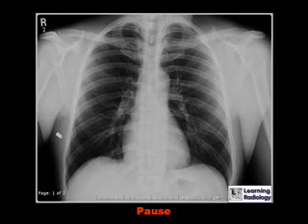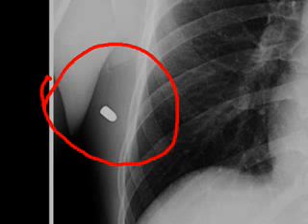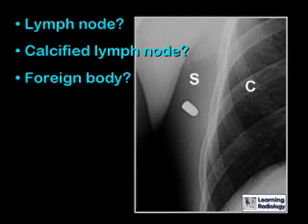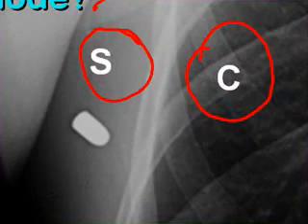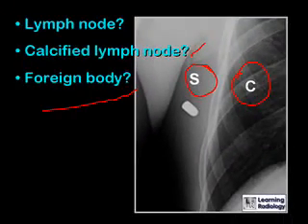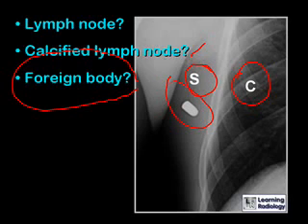Here's a chest x-ray — you can pause to determine where the abnormality is and what you think it might be. You were correct if you identified an abnormal density superimposed on the right axilla. If we examine its density more carefully, we can tell it is not a lymph node, because a lymph node would be the same density as all the other lymph nodes in the axilla. It's actually much denser than soft tissue, and it's not a calcified lymph node because this is denser than calcium in the ribs.